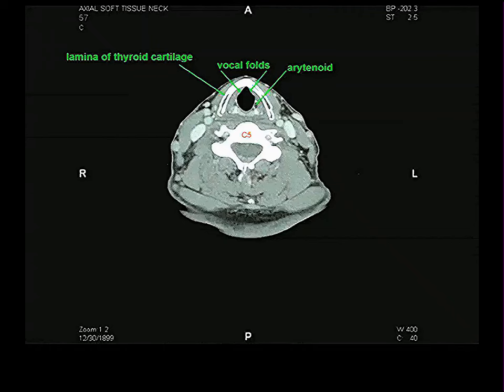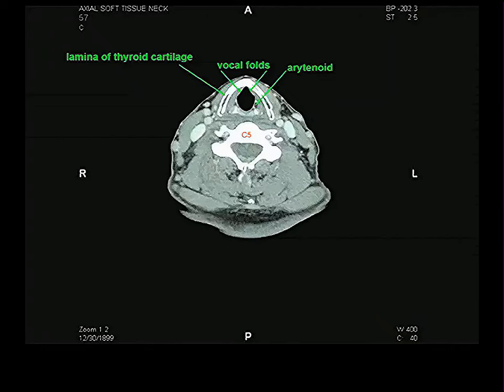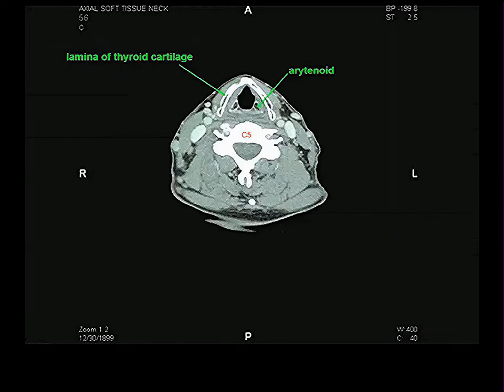And I thought it disappeared here. And I thought this thing right there was the arytenoid cartilage. I still think that's the arytenoid cartilage, the sort of whitish thing there with a black center. And one of the reasons I thought it was, I must tell you, is because these are the vocal folds. Now, how do I know those are the vocal folds? When you look at your airway, it's rounded anteriorly, and then it starts to turn to a V. And the minute you get to that V, the anterior V of the airway, those are the vocal folds. So if these are the vocal folds, I know the vocal folds are attached to the arytenoids, so these must be the arytenoids.